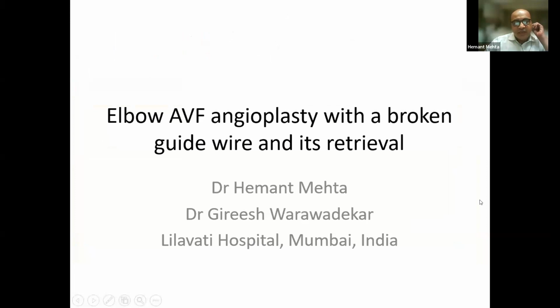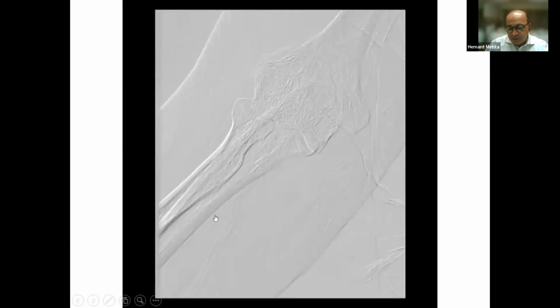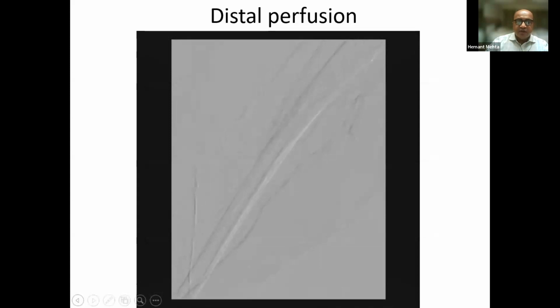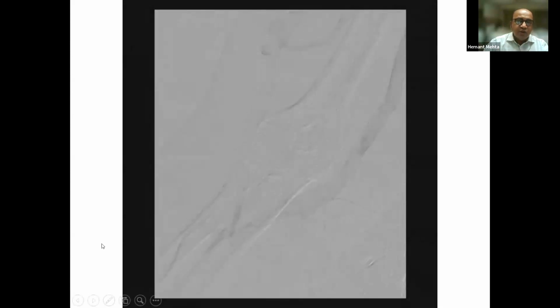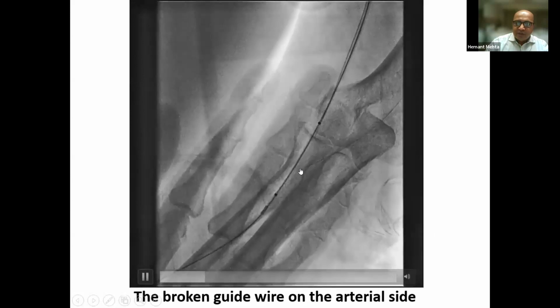So this is the first case where an elbow AV fistula angioplasty was being done and the wire broke, and how we retrieved it. Now, when we are dealing with a fistula, many a time we have to first study the whole circuit. Sorry, the first video we missed. Anyway, there was this distal perfusion chart, and right up to the palmar arch, as you see here, the circulation is intact. Then there is this anastomotic site. We had put a wire from the venous side, and we thought we would be able to cross this way, but it didn't happen because it had a kink.